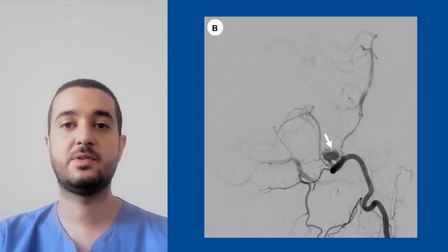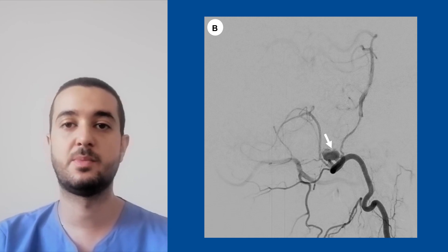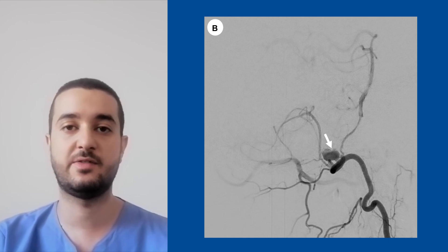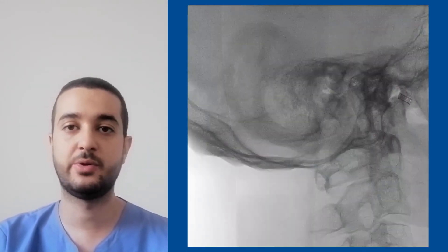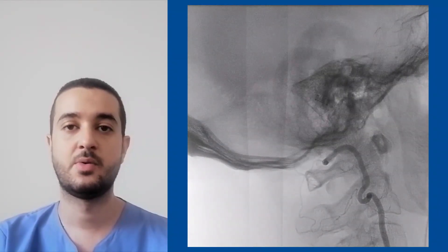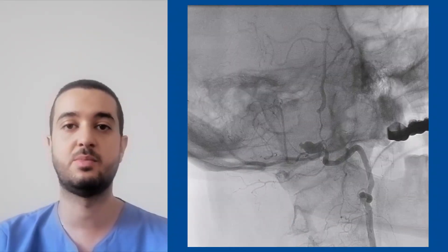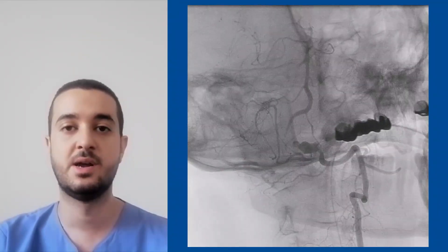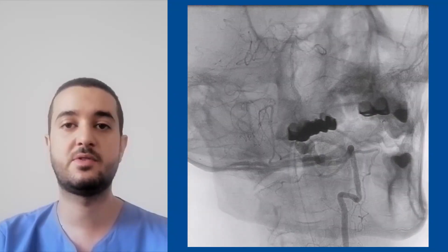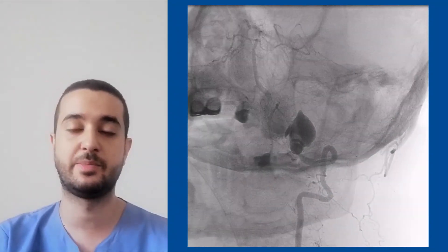Initial percutaneous left vertebral artery angiography confirmed an irregular circular aneurysm along the proximal aspect of the left PICA. Unfortunately, during 3D rotational angiography, we noticed a massive contrast agent extravasation after bolus injection originating from the aneurysmal dome, indicative of aneurysm rupture.